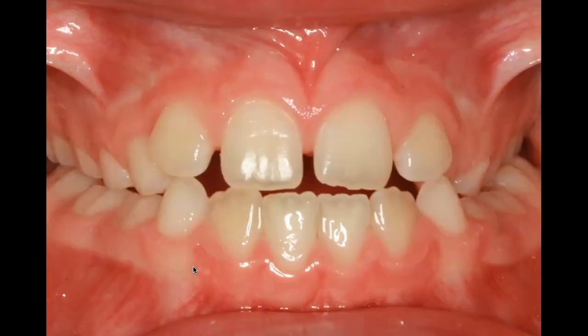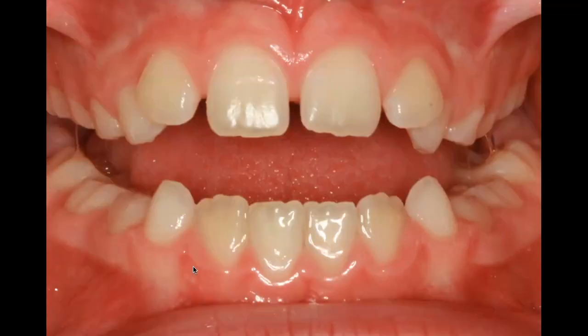Okay? Does she have lower incisor wear? Not so much. A little bit, maybe on that upper right central. Is it due to a deep bite? Yeah, not in this case, right? Maybe some anterior wear. Those are the edges there. You can see them a little bit better. And at this point, you can definitely see the first and second primary molars quite submerged.